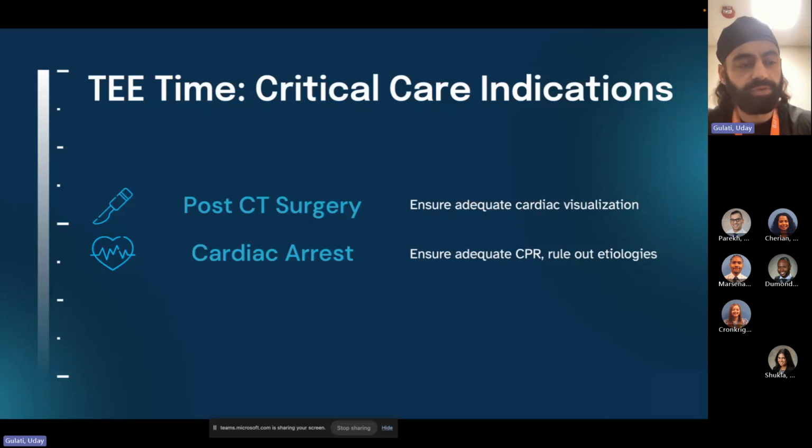If you are adequately careful, in the literature, you don't see complications of damage to the probe. Just flying through the literature, that's not one of the reported complications. The complications that you see are in the oropharynx, trying to potentially emergently place it, potentially injuring the teeth. With any TEE manipulation, if you don't do it safely, you can cause a bit of bruising in the posterior oropharynx and things like that, especially in these patients that, for whatever reason, arrested and are more likely to have poor perfusion and things like that. So it does have to be done safely.